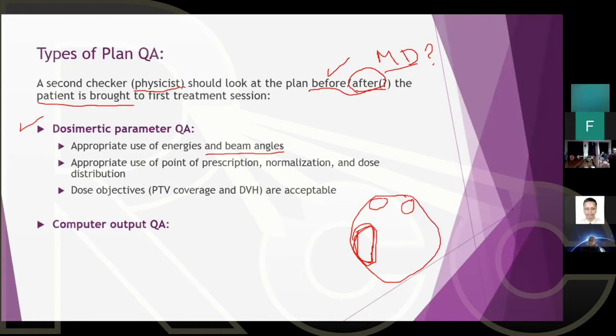And the answer is because sometimes minor things might not be of importance to the radiation oncologist, but they are of importance to overall treatment. And most of the time, the oncologist is very concerned and concentrating his or her effort on the conformality and the high doses that they forget about low doses. In this particular case that I'm mentioning, and it happened very recently, everything looks good when you're looking at the high isodose conformality. DVHs looked really, really good.